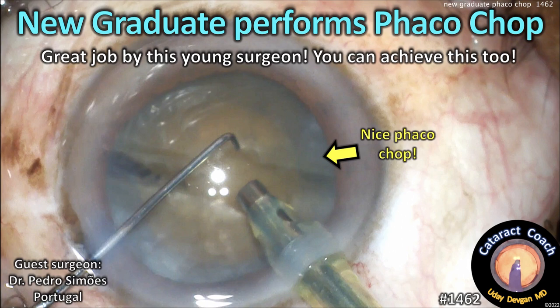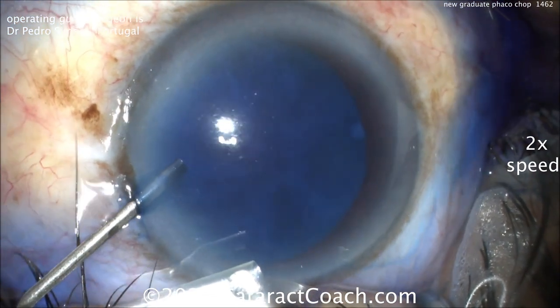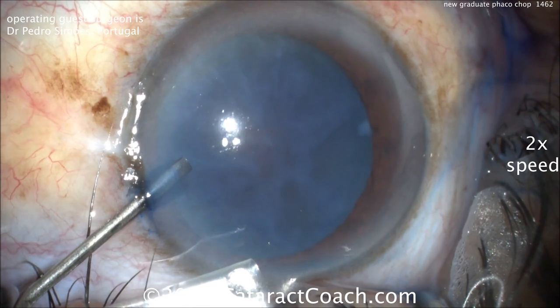CataractCoach.com. A new graduate performs Faco Chop. So great job by this young surgeon, and certainly you can achieve this too. Our guest surgeon here is Dr. Pedro Simones from Portugal, and he's doing cataract surgery.